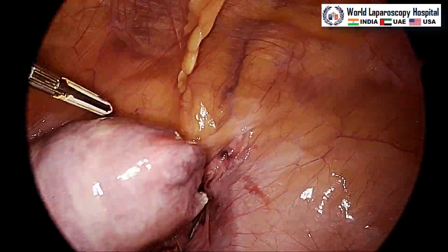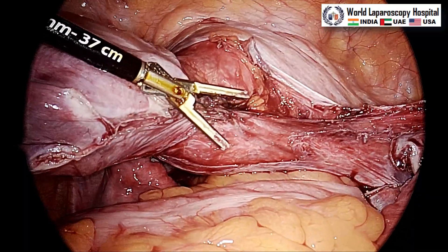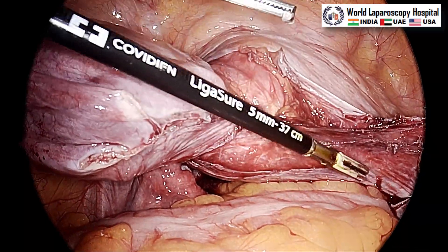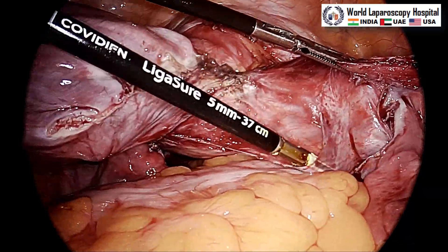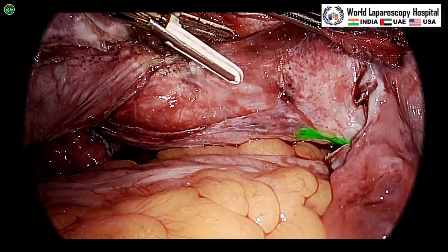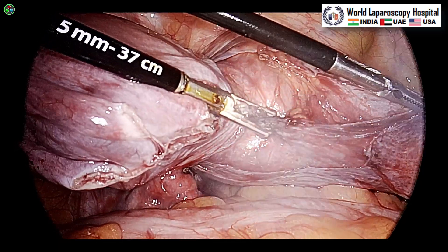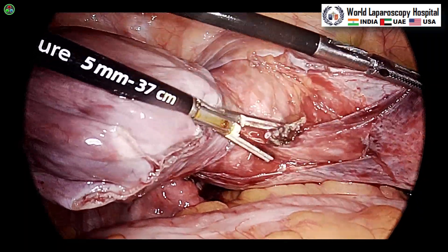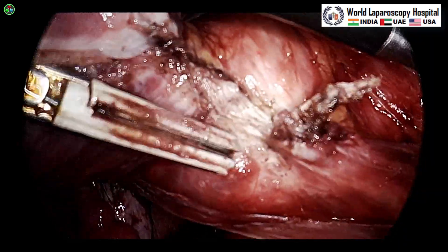After taking the left uterine artery, we will take the right uterine artery. The assistant will do contralateral traction, the uterus will be at 9 o'clock position, and this is the right uterine artery taken. In this mode you can see the ureter just below. A common mistake in surgery is going too lateral and catching the ureter. Always try to remain near the uterus, especially when taking the uterine artery. The right uterine artery is secured and ICG helps confirm you are not catching the ureter.